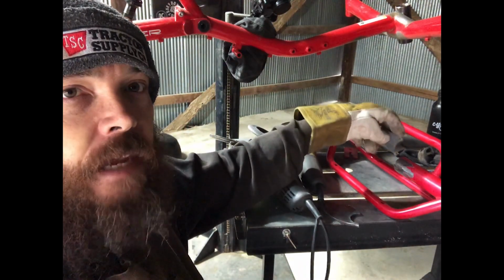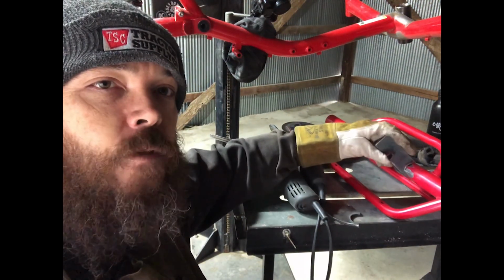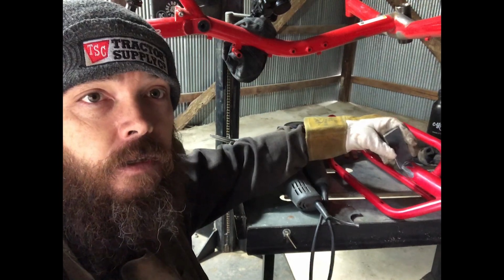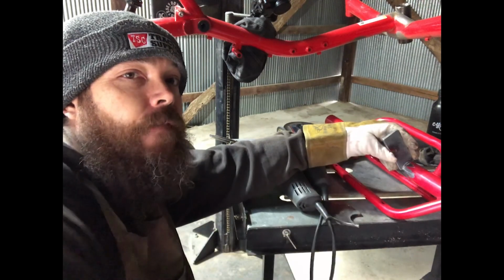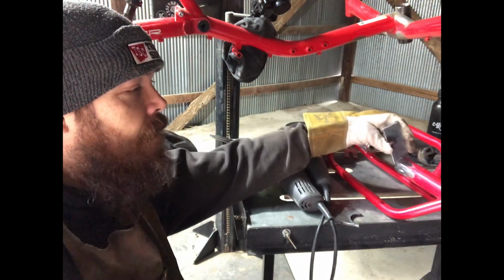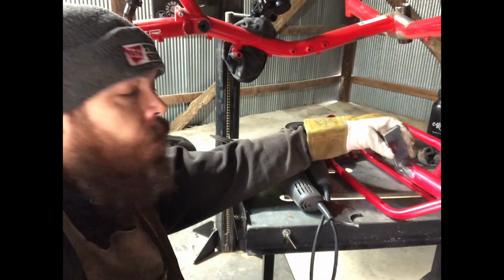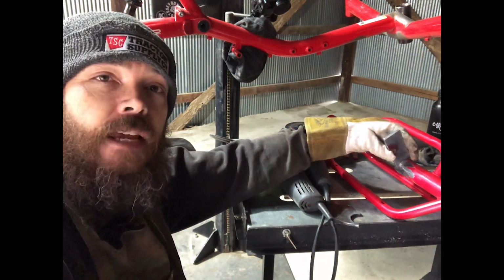and that way I could use my table to not only keep them aligned this way, but then also this way, because you want to make sure that it's perpendicular to this part itself. So I want it to be at a 90-degree angle coming off of here, and we also need it in a specific location along this rail in order to meet with our swing arm. So that being said, I guess you have to stay tuned to see what we do.